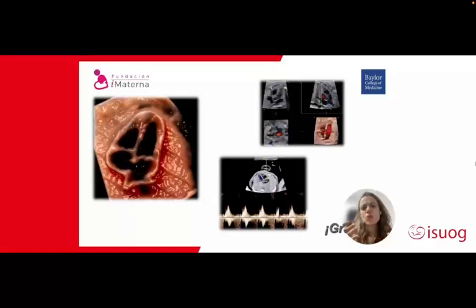We don't want to waste our time in repetitive tasks that we don't really need skills or specific knowledge for, like placing calipers or calculating scores. If we save time from there, we can invest that into looking at other structures that we were not looking at for the sake of time before, or we can start measuring, because we don't measure because it's time consuming.